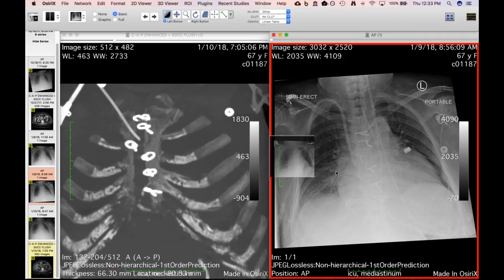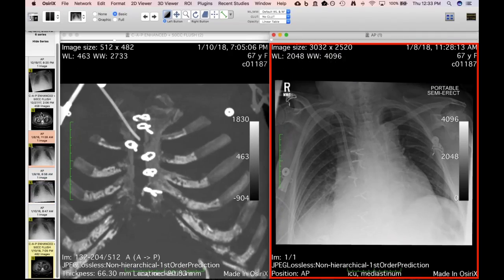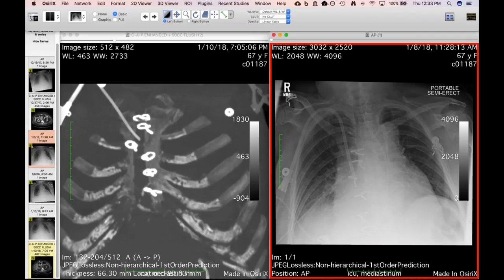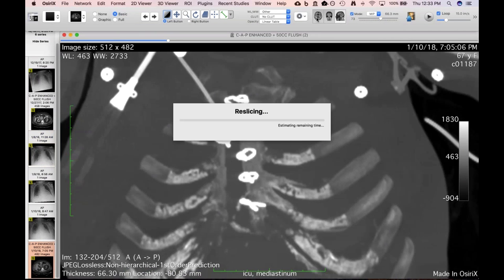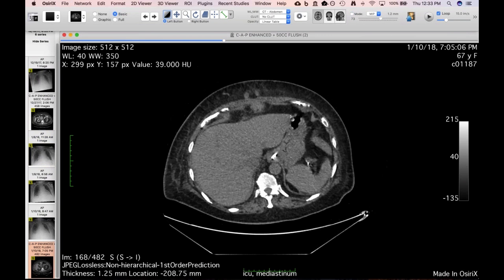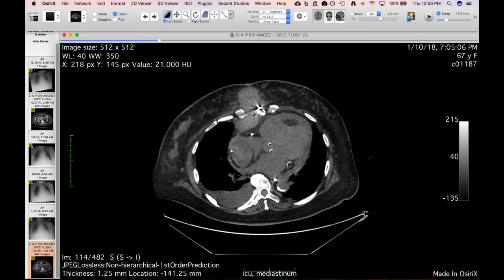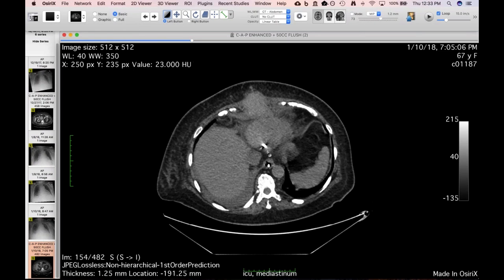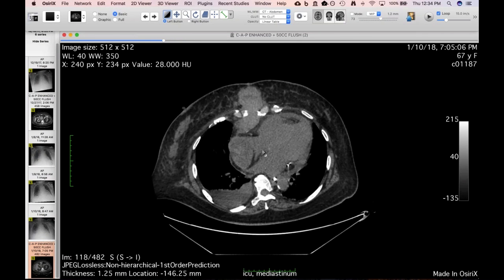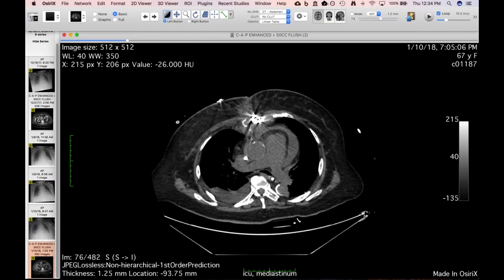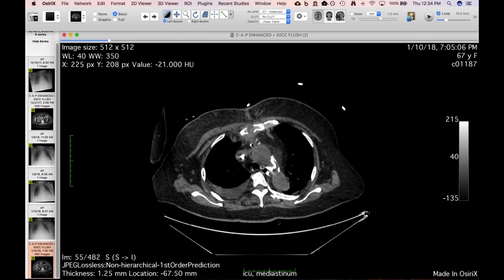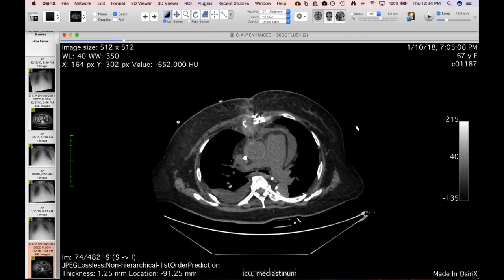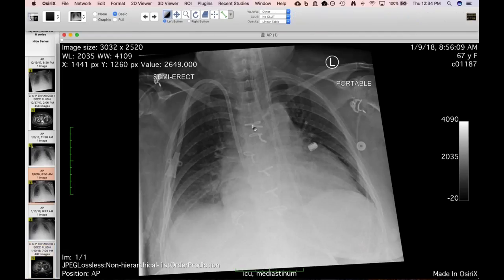You don't have to see zigzags — it can be just one wire that pulls one way, tears through the bone, and then all the others go the other way. This is a confirmed dehiscence — probably there for a day or two. Most of the finding was hematoma, not infection, and they went in to evacuate it.